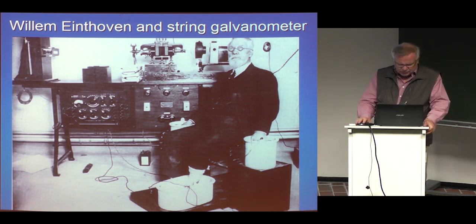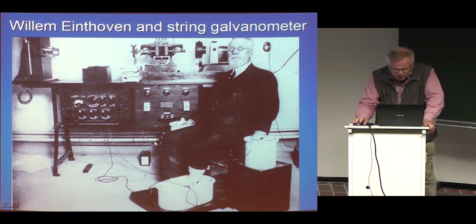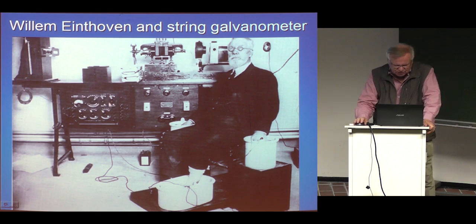In the string galvanometer, I show it in some more illustrations. You first see that there are some selection connectors here. They are quite large in size. They are like today the high voltage instruments, electric power systems have this kind of switches, quite big ones.